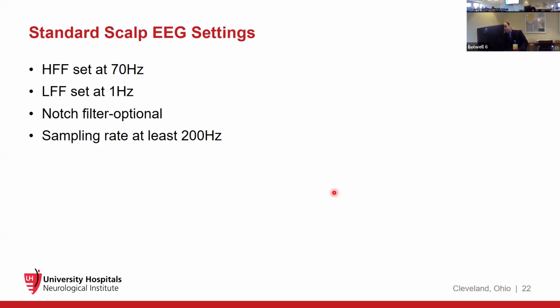Now you might ask, why don't we just sample at high speed for everything to get high quality data? That has to do with storage. The higher your sampling rate, the more voltage points you're going to store. You're going to run out of server space really fast, whatever lab you're working in. That's why every lab, sleep lab or neurophysiology lab, has techs who have to clip the recordings, particularly longer recordings.